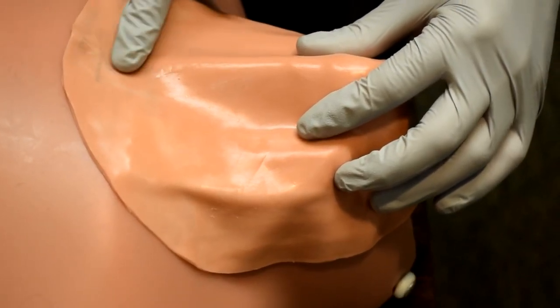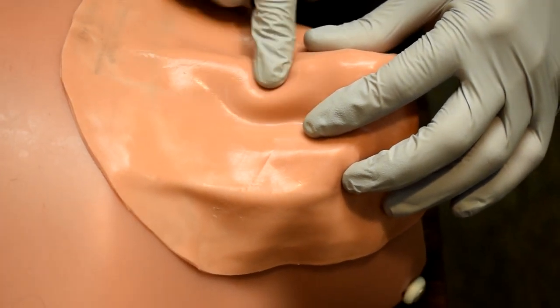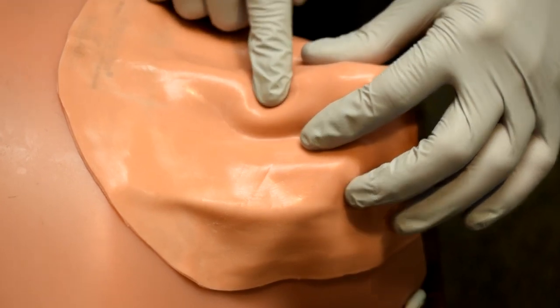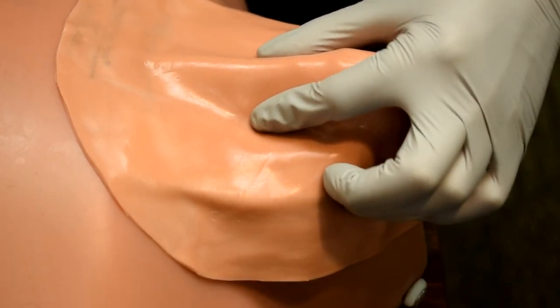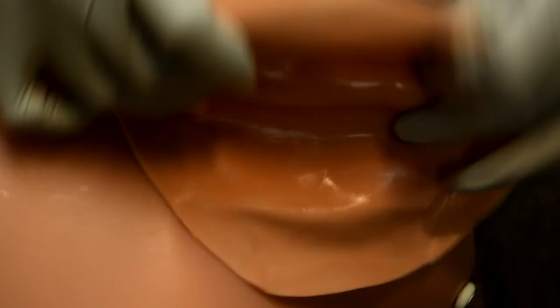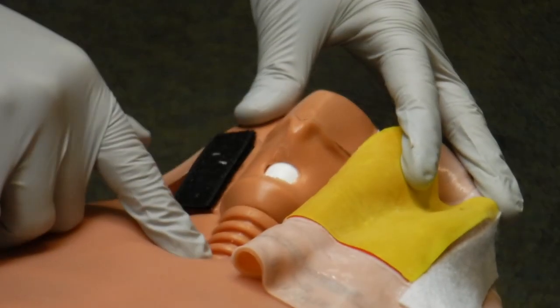So once again, easiest to feel from the bottom and quickly feel up, hit something hard, then a divot, hit something hard, and you are working between the two hard structures. So I'm going to use my left hand to stabilize that airway. Now as a review, we're going to open the skin here and look at the model. And what you can see is what we've demonstrated. We're working down here at the sternal notch.